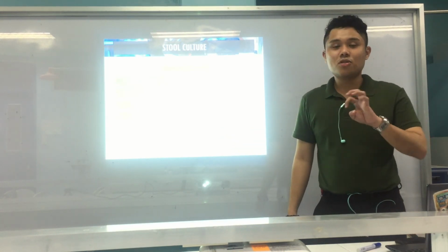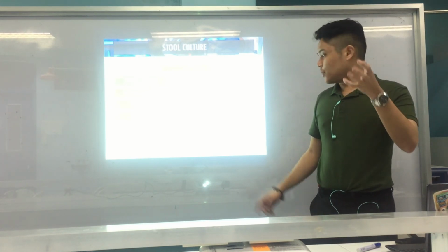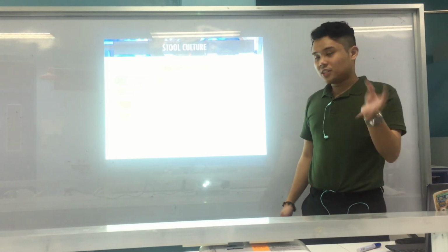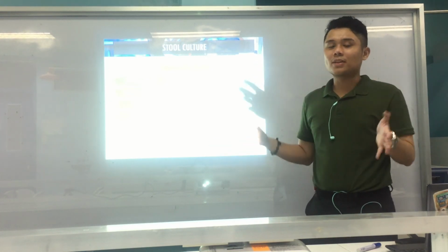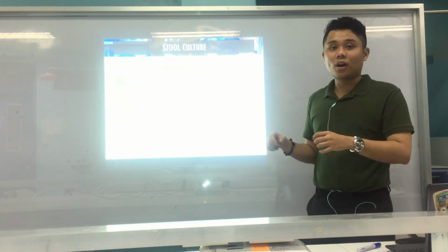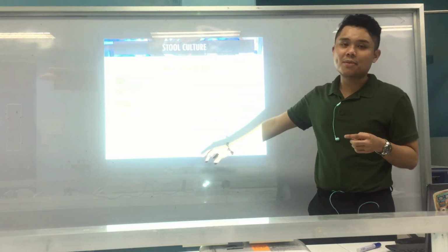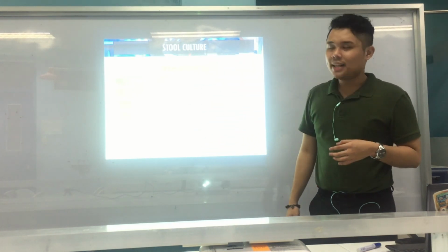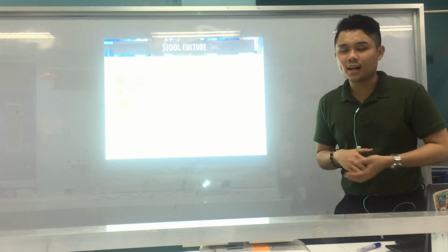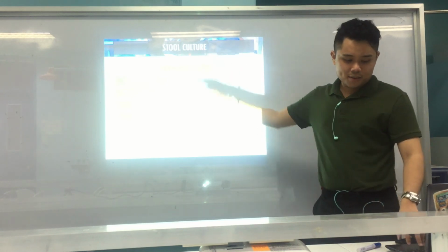Non-fermenters do not ferment carbohydrates, but they either oxidize, in which case the term is oxidizer, or they do not use any sugars or carbohydrates at all, in which case the term is inert or asaccharolytic. Okay, just some terminologies, I'm sure you're all familiar with them. They're self-explanatory. This is just to guide you when you read textbooks or articles later on.